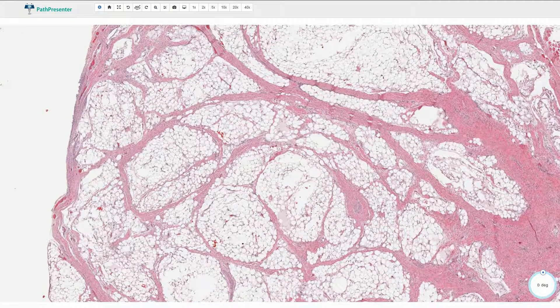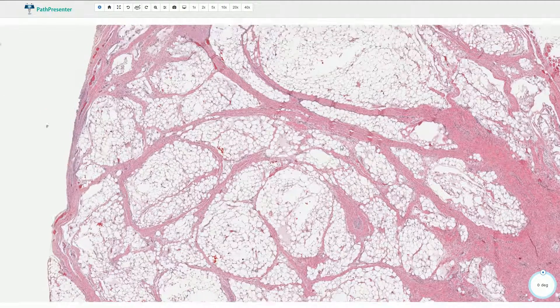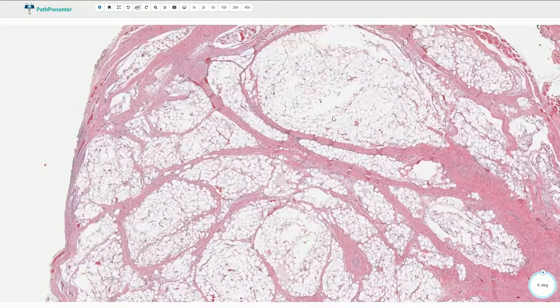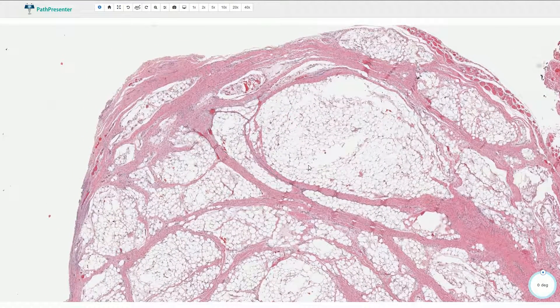Under the microscope we can see the lobulated appearance of the tumor. These lobules are divided by fibrous septae. Some of these septae are thin, some of them are thicker, so irregular fibrous septae are quite typical for this lesion.